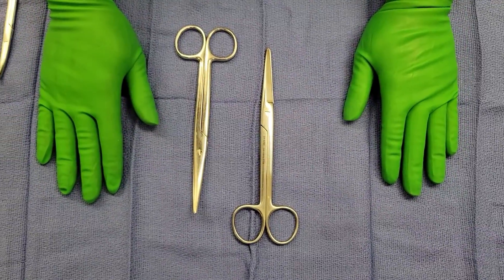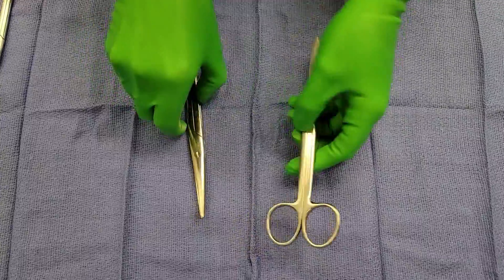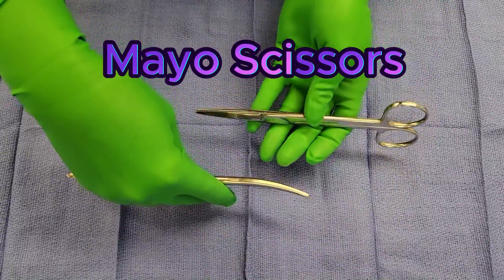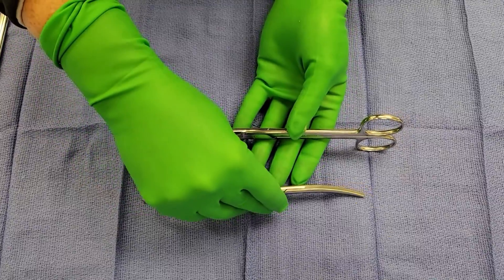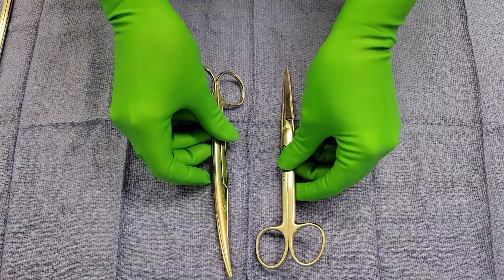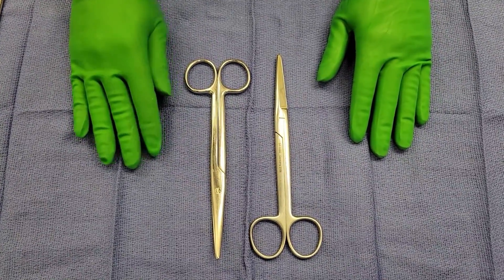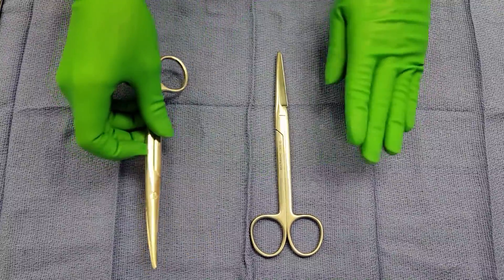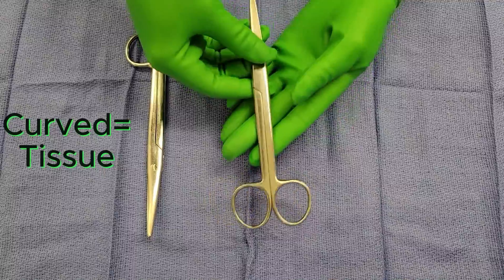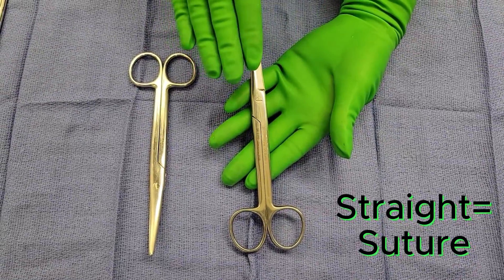Hi everybody, welcome to another episode of Surgical Instrument of the Week. This week we're going to be talking about Mayo scissors. As you can see, Mayo scissors come in a curved and a straight variety. These are heavy-duty utility scissors — the curved variety is used to cut through heavy tissue, and the straight variety is used for cutting through suture.